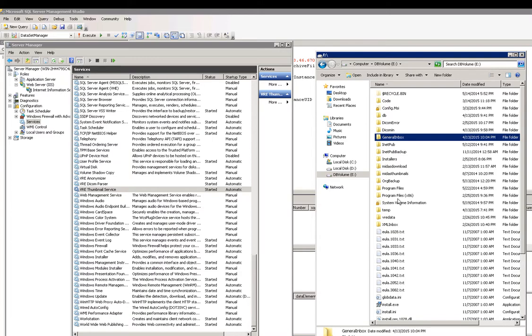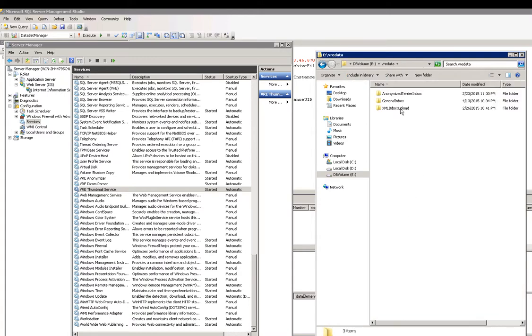But for data sets that may or may not be anonymized, you're not sure, there's a different inbox under the subfolder VRE data. The flow of the data would be the following. First it goes into folder A, the files are anonymized, they're moved into a secondary folder, folder B, and then the files are consumed in the system from there and pulled into its own internal archive.